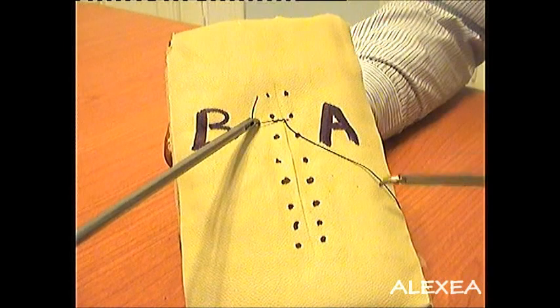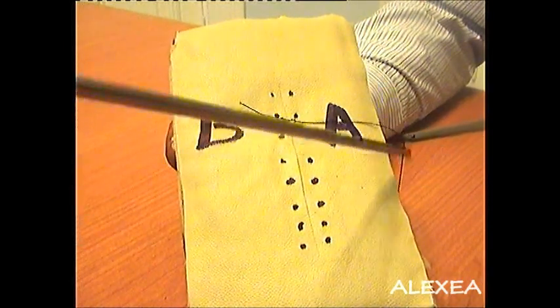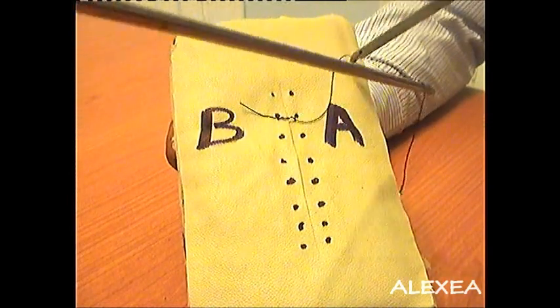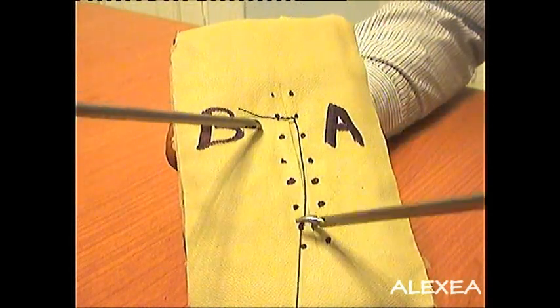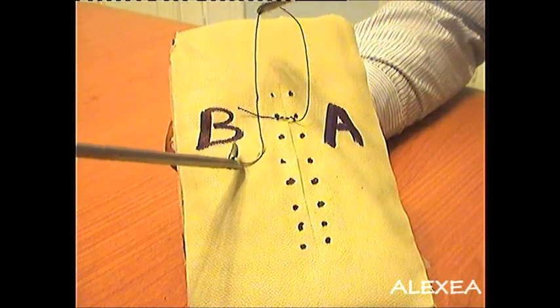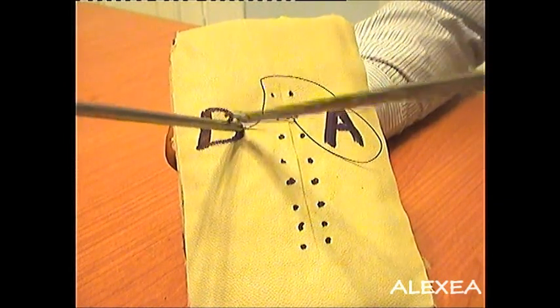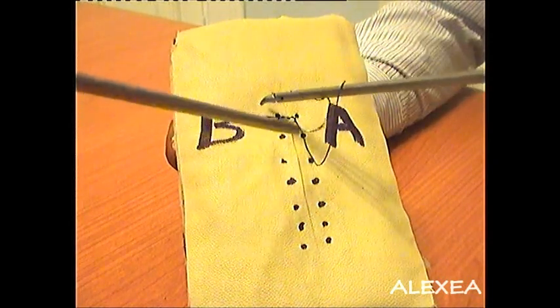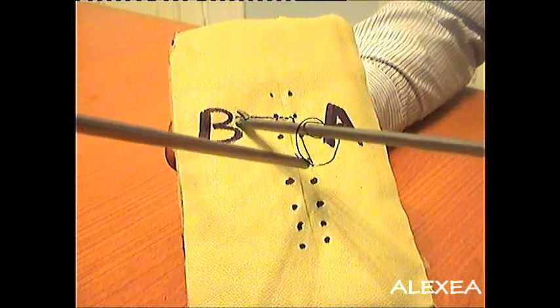In preparing knot number 2, take the long end towards side B. It is important that when planning a knot on side B, the needle is held with the instrument on side B nearest to the short end. Use your right hand. Knot number 1, pull it higher. Knot number 2, pull it higher so that the knot doesn't slip.